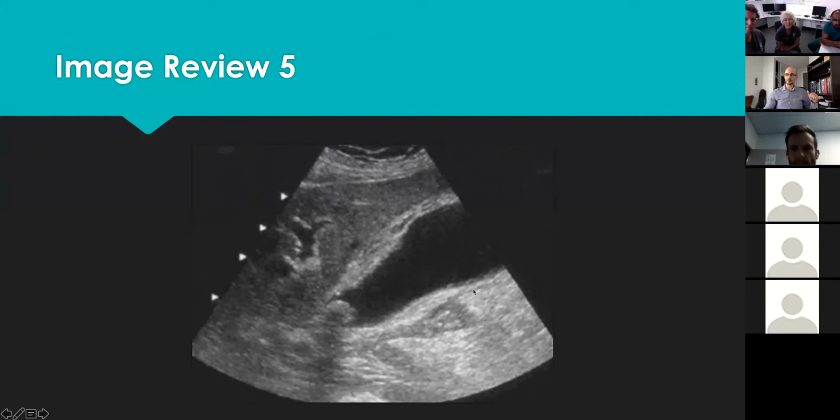That there. Okay. Yep. And look, there's a little bit of echogenicity inside it, but this shadow is still hypoechoic in comparison to the area around it. So it still counts as pretty much a clean shadow. So this looks to be a stone with a clean shadow after it.